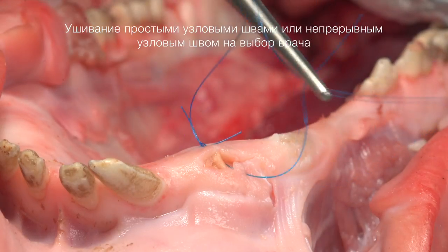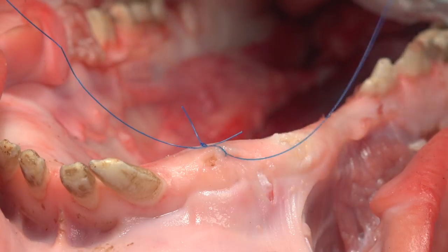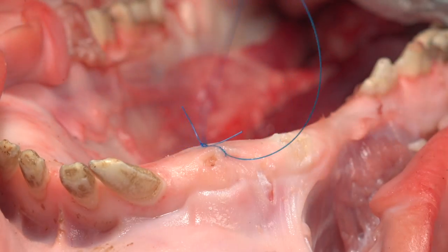В данном случае сшивание можно произвести либо простыми узловыми швами, либо узловым непрерывным. (In this case, suturing can be performed either with simple interrupted sutures or with a continuous interrupted suture.)